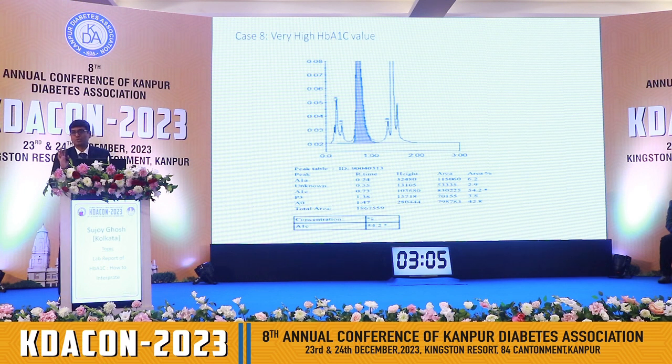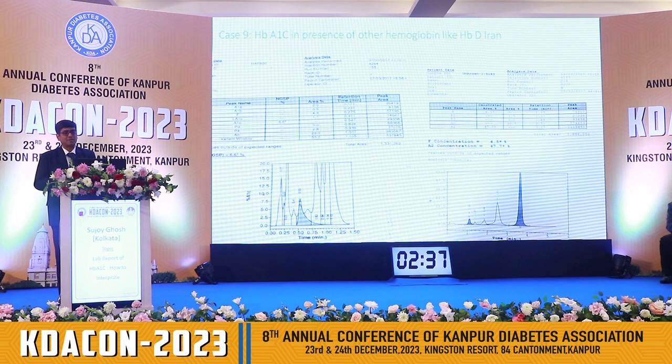I did not know what to do in this patient. And then I went up and read up literature and found that there is something in Kerala that happens called hemoglobin Hope disease. I actually went back and traced the family, and several of the family had hemoglobin Hope disease, which means that where the HbA1c elutes, this just goes and elutes on top of that. So this hemoglobin is interpreted as hemoglobin A1c. So we published that as well.